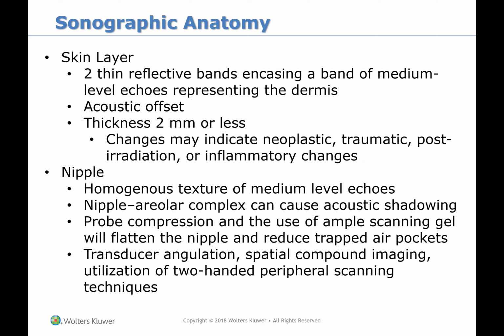The nipple is homogeneous texture. It's difficult to look underneath the nipple because of the shadowing. But probe compression and the use of ample scanning gel will flatten the nipple and reduce trapped air pockets. Transducer angulation, spatial compound imaging. There's different techniques that you can use to see underneath the nipple, but if you're just looking at it, it's going to shadow.